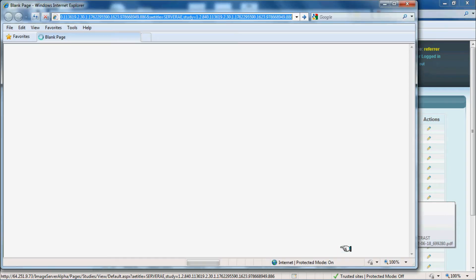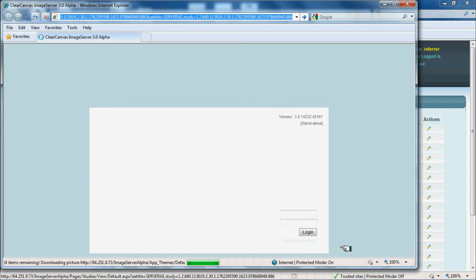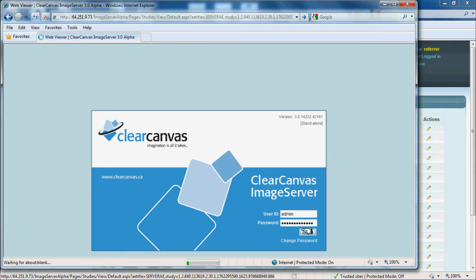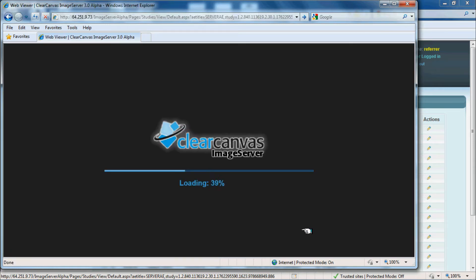If they click on the DICOM images, they'll be prompted for a username and password, and then the images will download to their computer immediately.